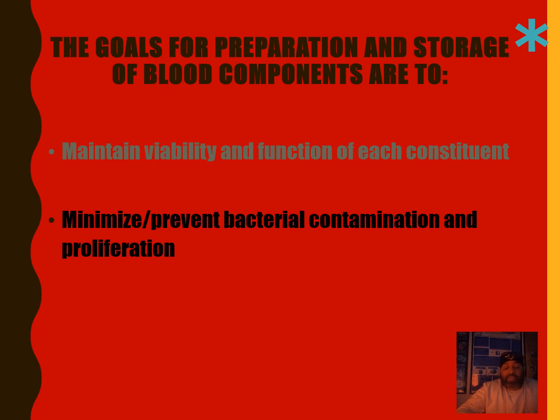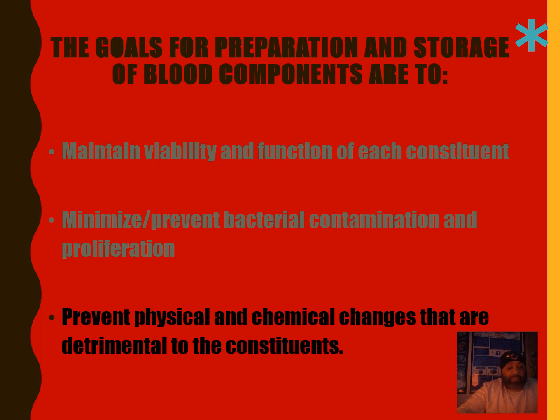particular blood cell components, the patient who requires them is not compromised or at risk of having a bacterial contamination through the blood that has been issued and requested for them. Then one of the other goals in preparation and storage of blood components is to also prevent physical and chemical changes that are detrimental to the constituents.